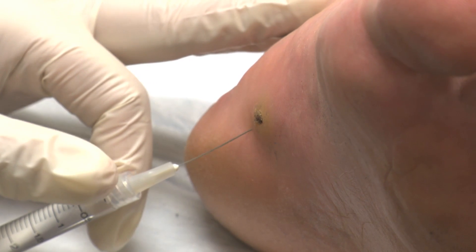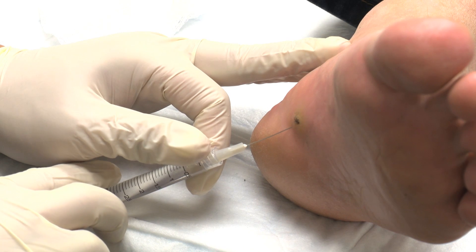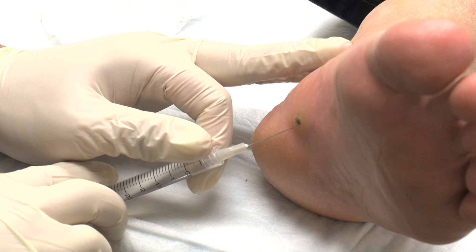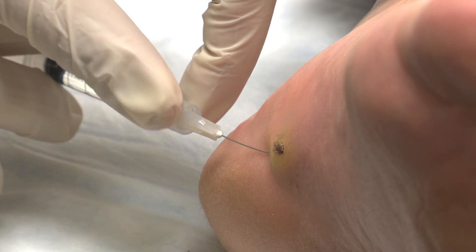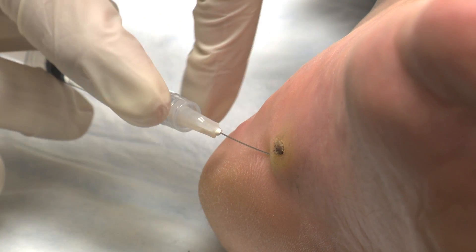Administer local or topical anesthetic depending on the wart type, size and location. In this video, the wart was deep enough to justify lidocaine injection as it required epidermal scraping.